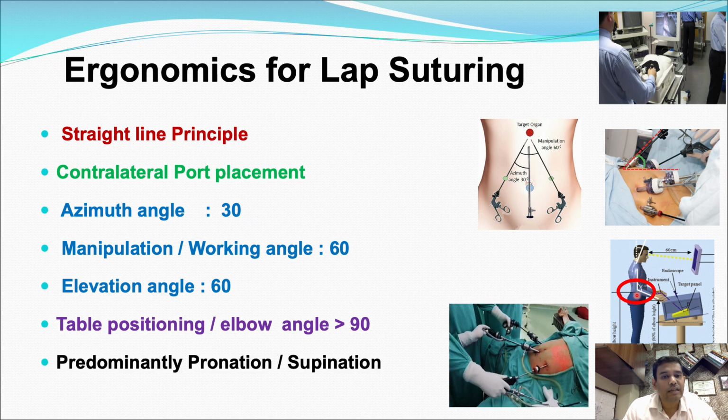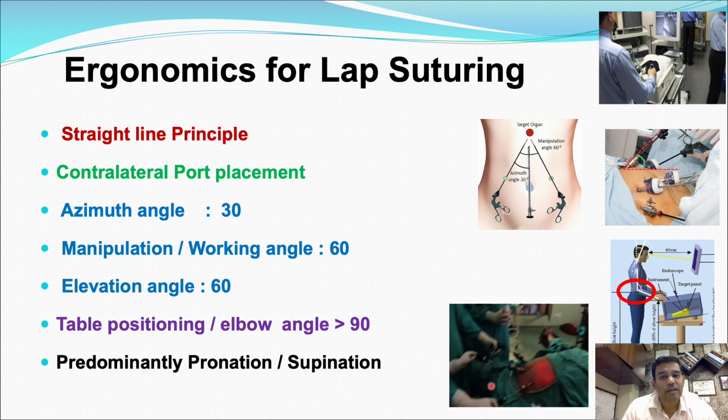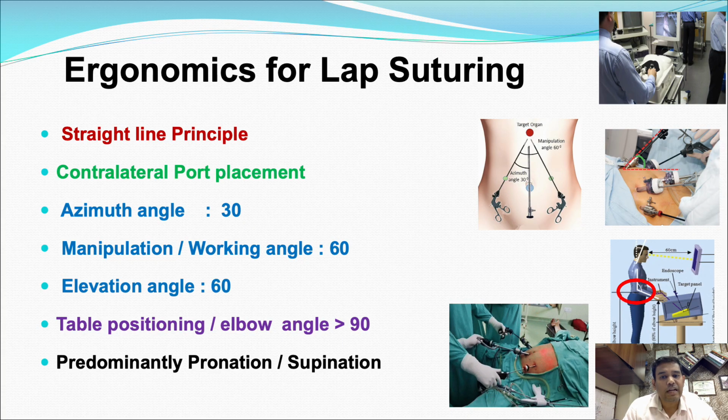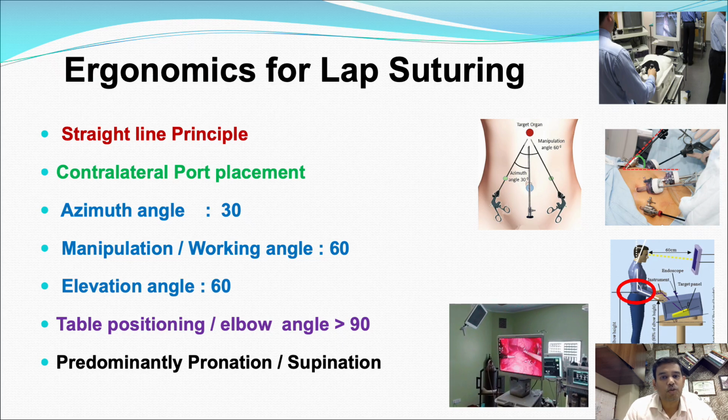And third, predominantly you make a pronation and supination movement with your hand. There is no right to left movement or up to down movement. The most predominant movement which you do for suturing is your pronation and supination movement.